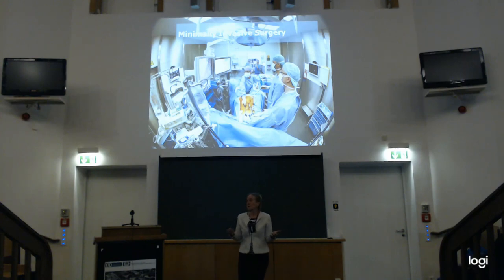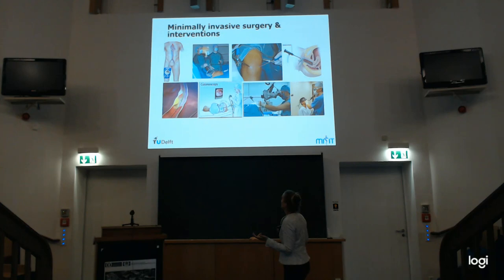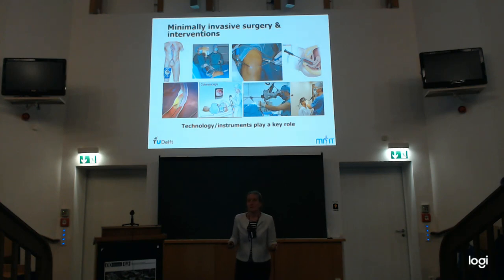And the many tools we try to develop are also used in procedures that are not only surgery. It's also catheter interventions, needle interventions, interventions in the arthroscopic, in the knee, for example. Also in the uterus, in the intestine, the colon, but you can also think about procedures in the brain. So there are a lot of procedures where you can think about going through tiny incisions, tiny openings into the body. Technology plays a very important role there. In the end, it's the technology that determines what the surgeons or the interventionists can do or not. So that's why eventually it's very important to work with and come up with new ones.